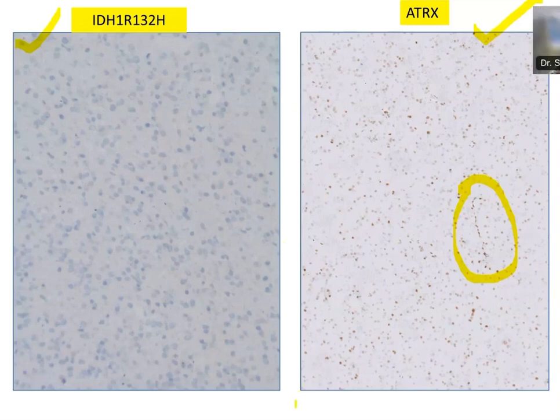So, an oligodendroglial origin? Why? What are the oligodendroglial molecular markers? It also has to be IDH mutant. Oligodendroglioma has to be IDH mutant and 1p19q co-deleted. First and foremost, only when you have IDH mutant findings can you think of oligo in the differential. Here, you're still not sure. Wild type? You did not decipher any further.